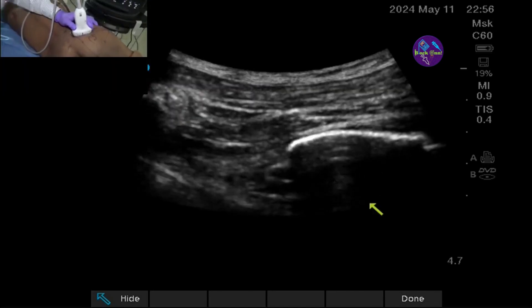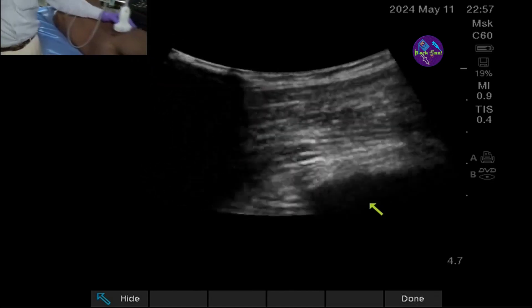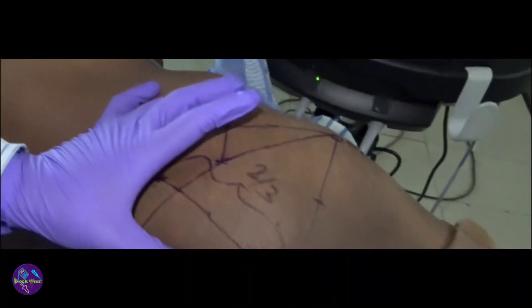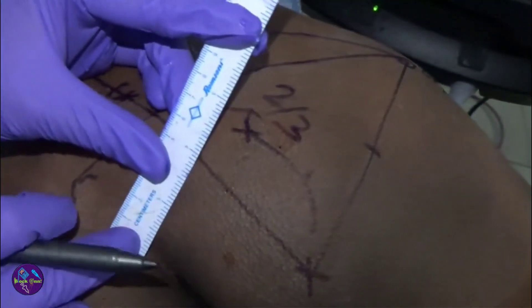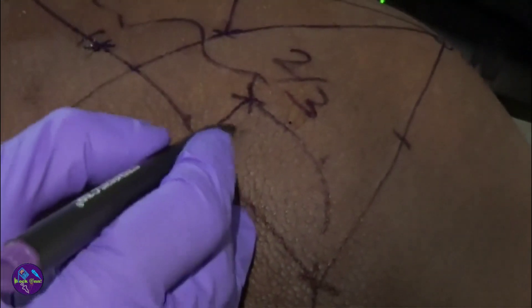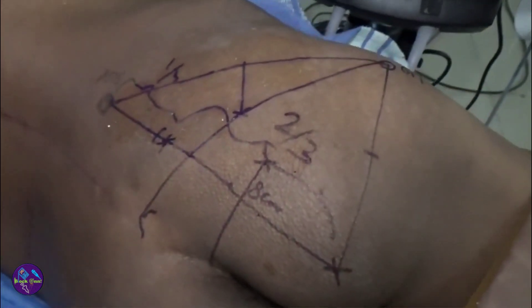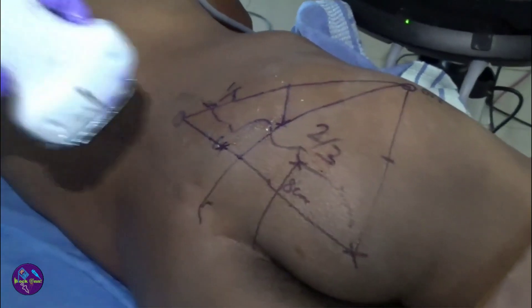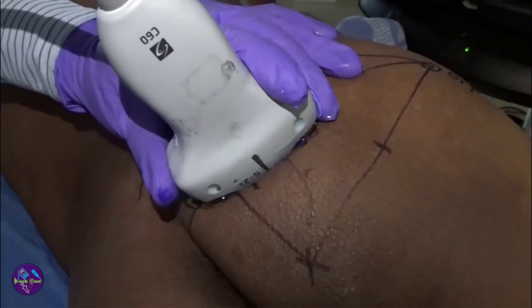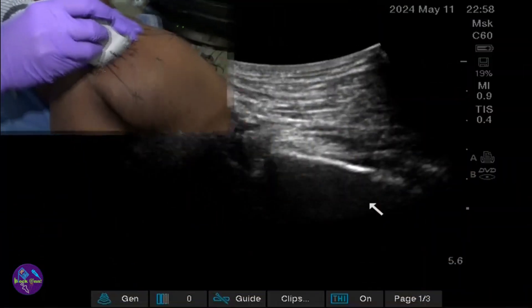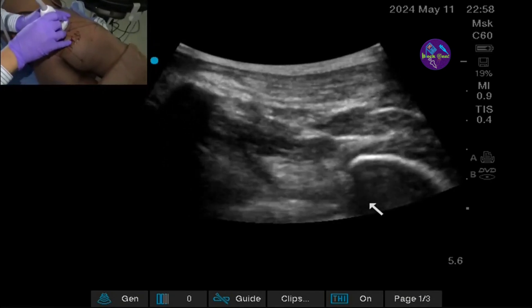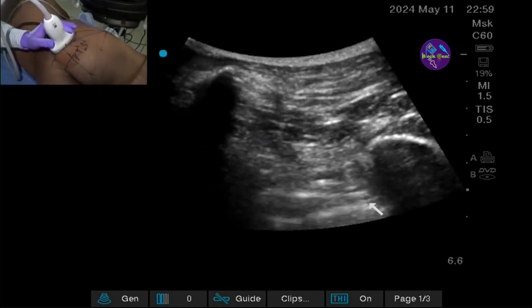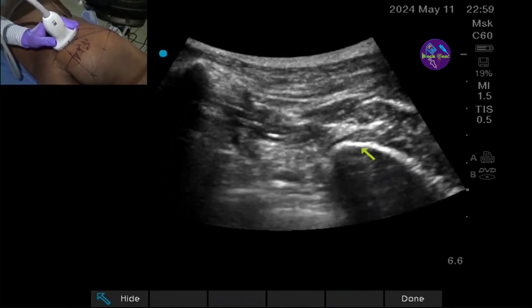Moving to the next approach: the Tahas approach. Identify the uppermost part of the anal cleft and go eight centimeters lateral from there. Keep the probe directly over this point, indicator towards me. If you are not able to visualize anything, just go up to get the straight line we discussed earlier — the ala of the ileum — and then come down again to find the gap between the bony landmarks, noting the change in the view of the ischium.